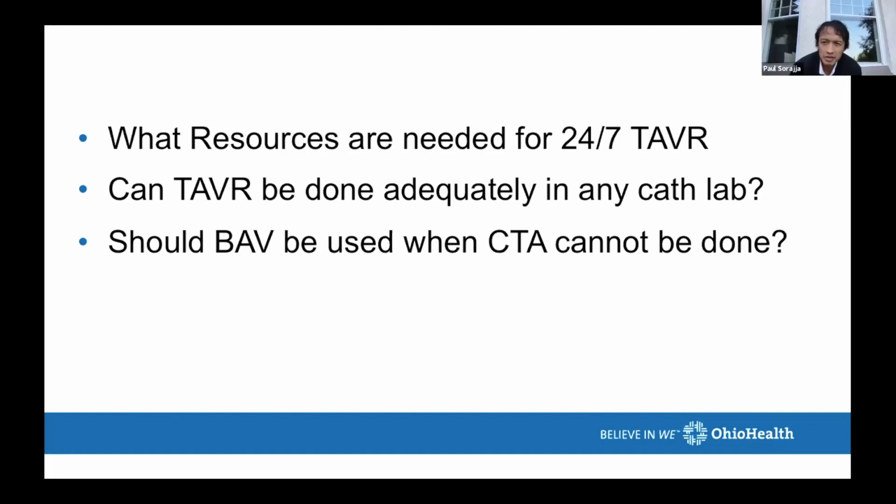We've had several emergent cases, and I've gotten calls in the middle of the night or the weekends to do them. And in one case in particular, we did no contrast whatsoever because the creatinine was very high. And I actually did 2 pigtails, one in the non and one in the left, and peripheral IVUS. And then we did a TEE just to make sure, and it went beautiful. And so I do think it is possible.